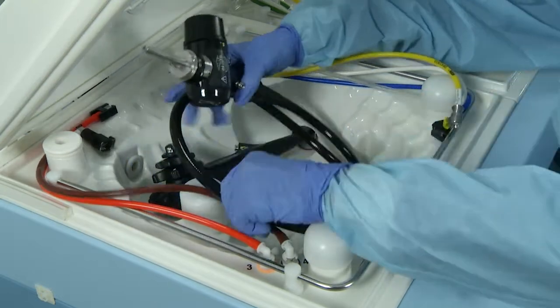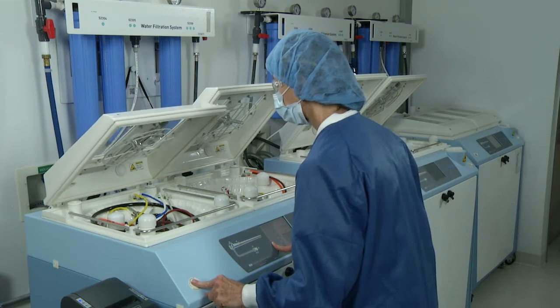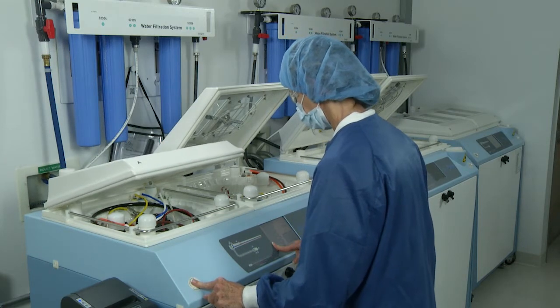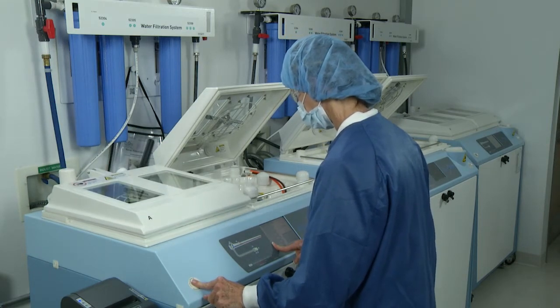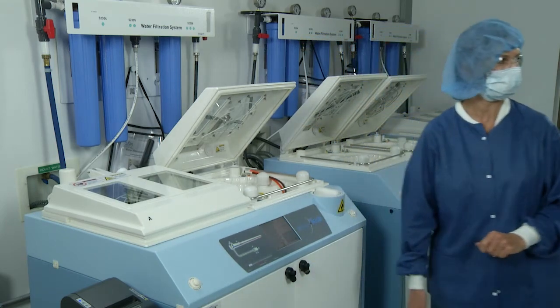Healthcare facilities should follow their own policies and procedures related to the reprocessing of endoscopes to ensure they are complying with all steps recommended by the device manufacturers and are consistent with current standards and guidelines.